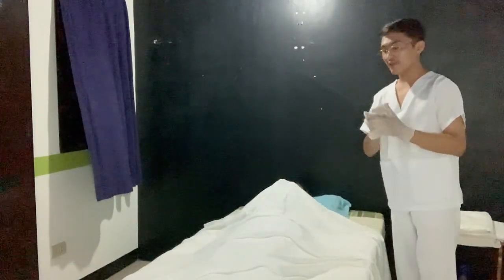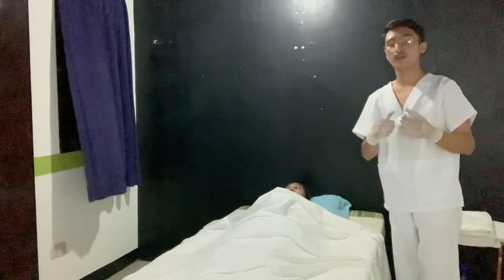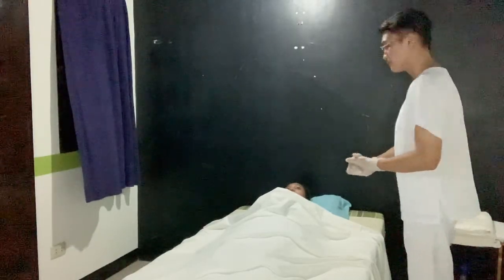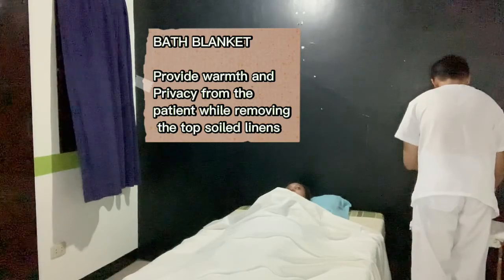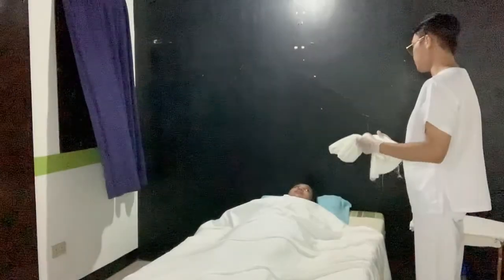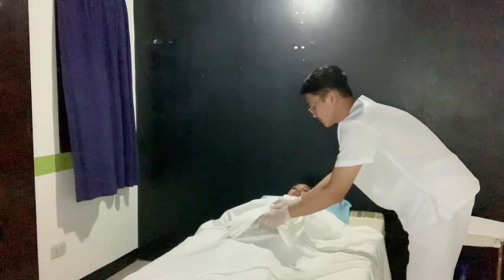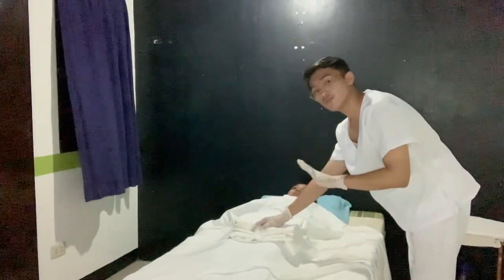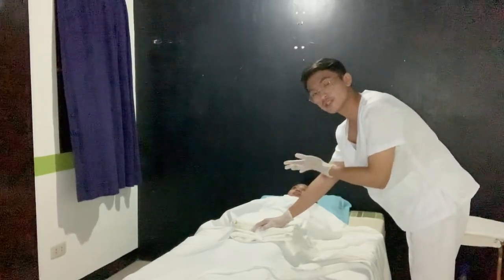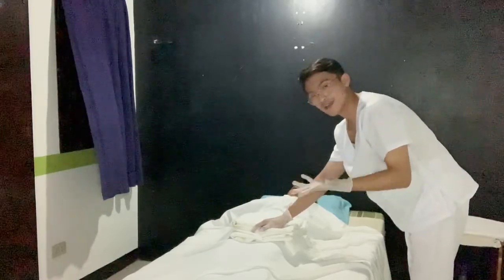Now I have already raised the bed of the patient and lowered the rails of the bed. I'm now going to grab the bath blanket and put it on top of the patient. So ma'am, I'm going to put this bath blanket on top, okay? Okay po. And make sure to unfold the bath blanket, and of course, make sure to encourage the patient to participate to promote some independence.